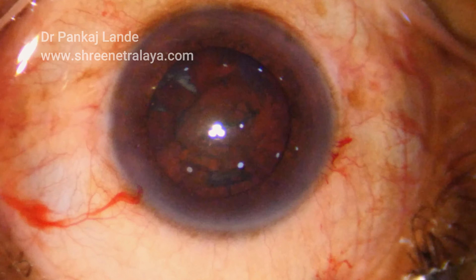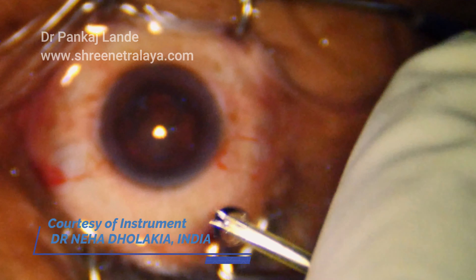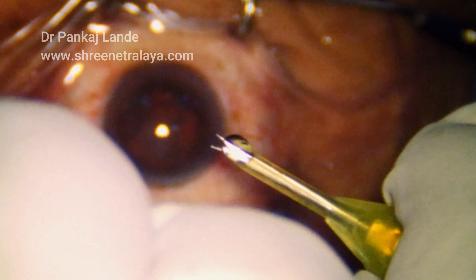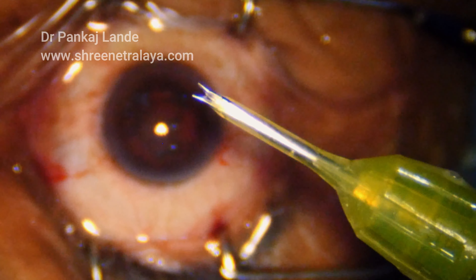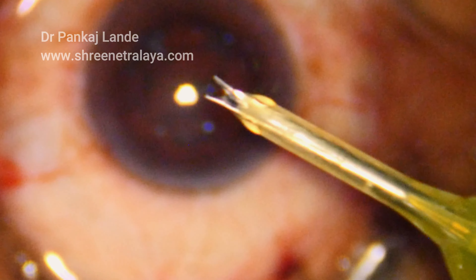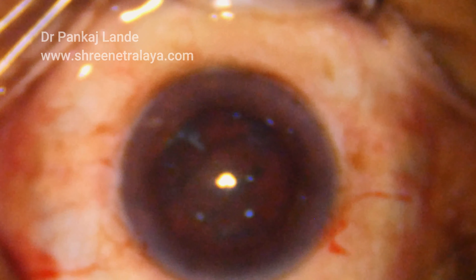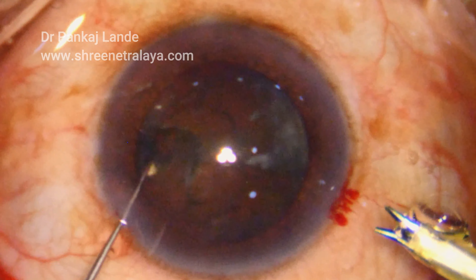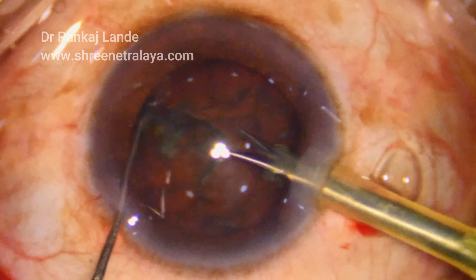This is a tip introduced by Dr. Neha Dholakia as an IOL cutter. It is a straight tip with a V-cut and a cutting edge on that V-edge. It is attached to the AMO Sovereign Compact with longitudinal power of 30. The V is outside the sleeve and it is a solid instrument — it doesn't have any vacuum; it will cut directly.